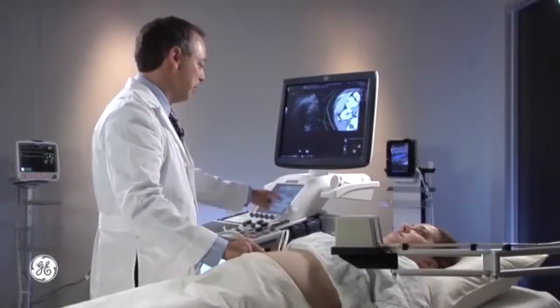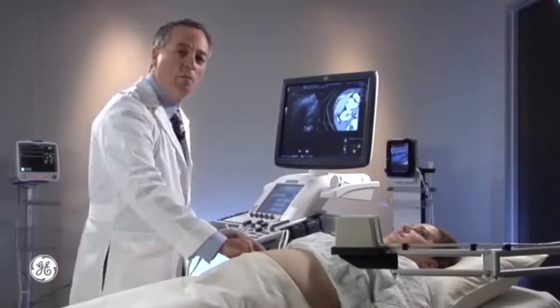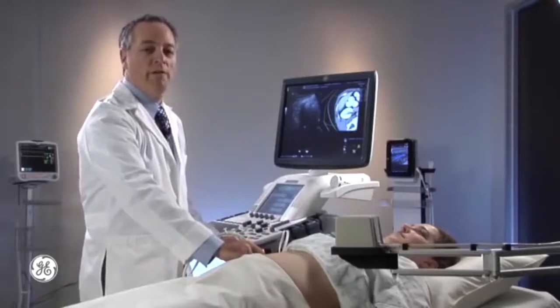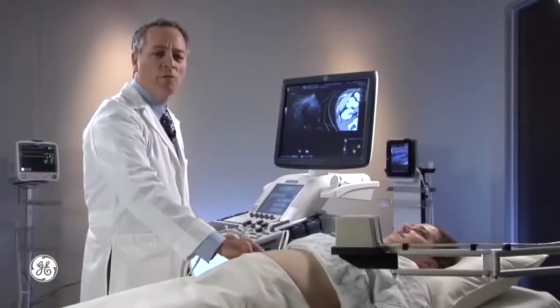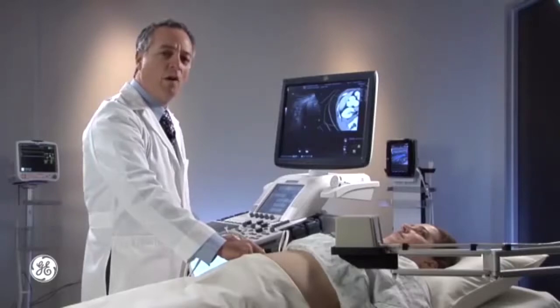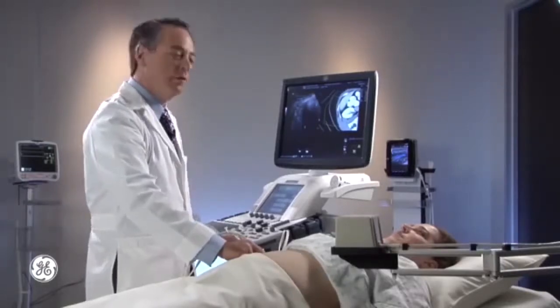Within the GPS pull down, I'm just going to delete that one and show you another example, which is using point. Point allows me to drop multiple areas of interest at the same time. So maybe I'm looking at a patient that has multiple cysts and I want to be able to mark all of them as I'm scanning to be comfortable that I'm looking at each one individually.